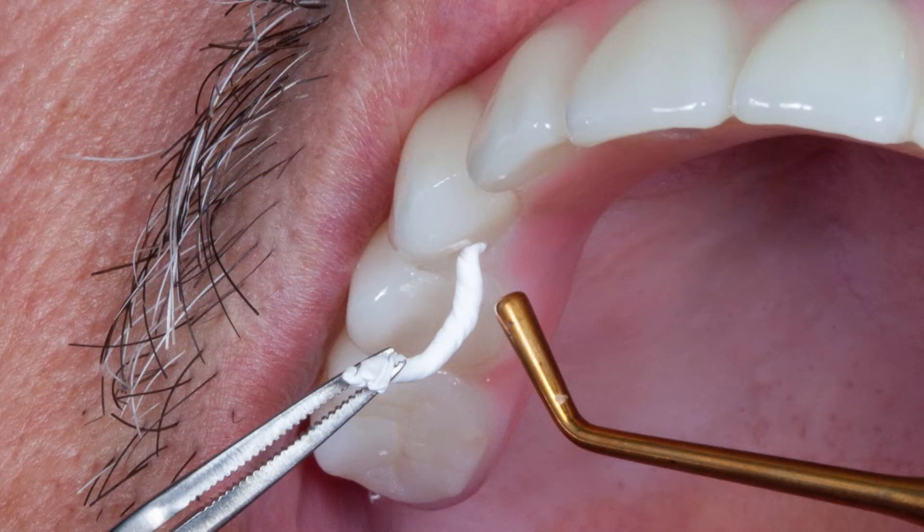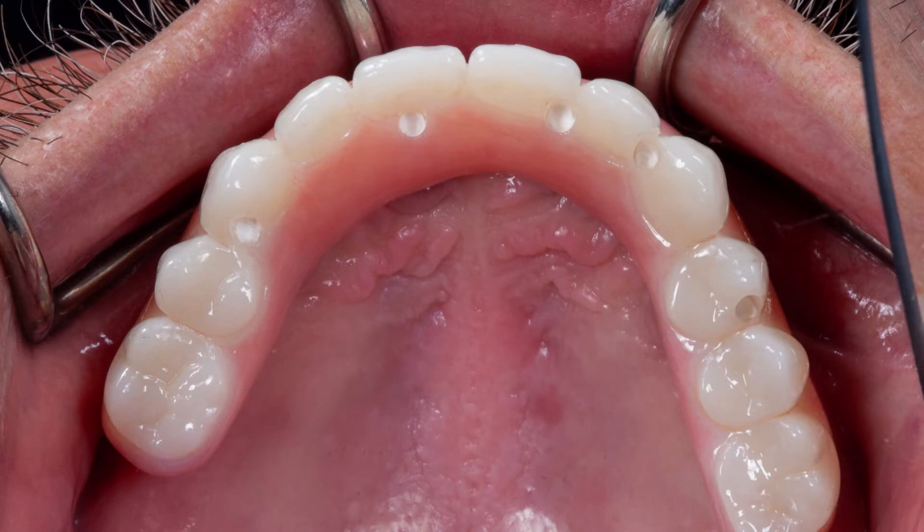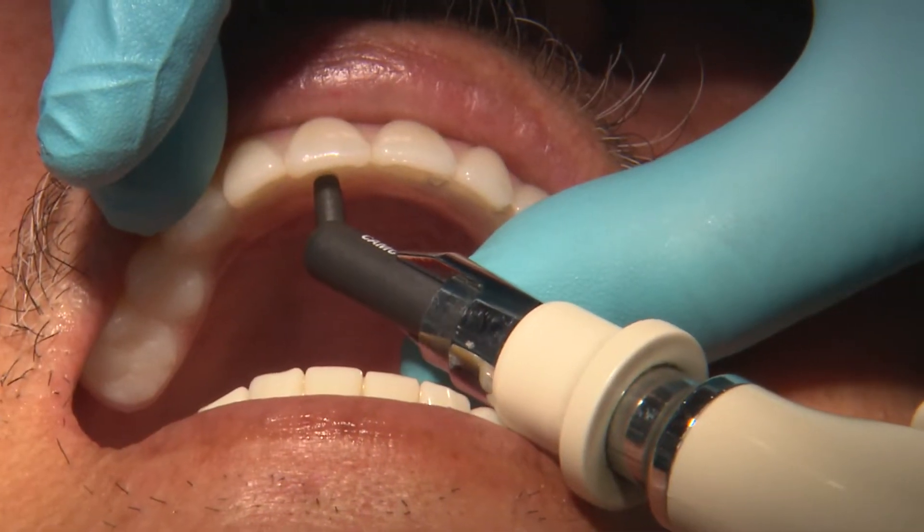The heads of our prosthetic screws can then be covered with a bacteria-resistant material, such as PTFE, also known as Teflon tape, and then covered with a light-cure composite.